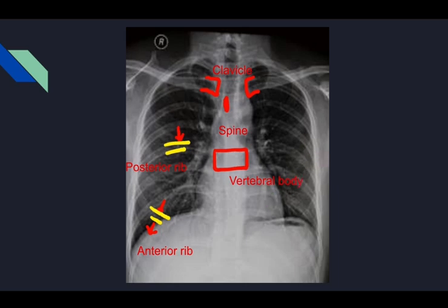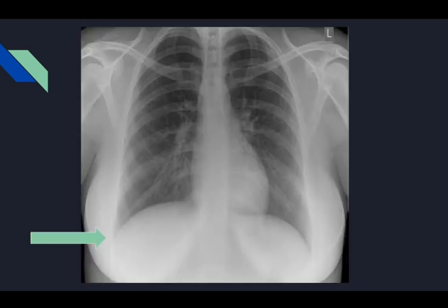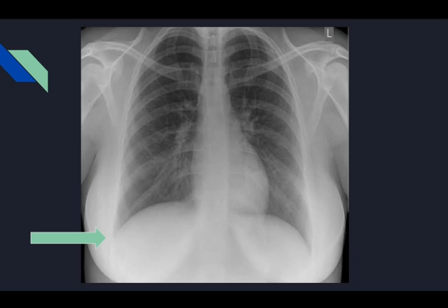Finally, look at all soft tissues visible on the X-ray for any soft tissue lesions, and check for asymmetry or anything present between the two breasts in female patients. That covers in brief the anatomy you need to know when reading a chest X-ray.